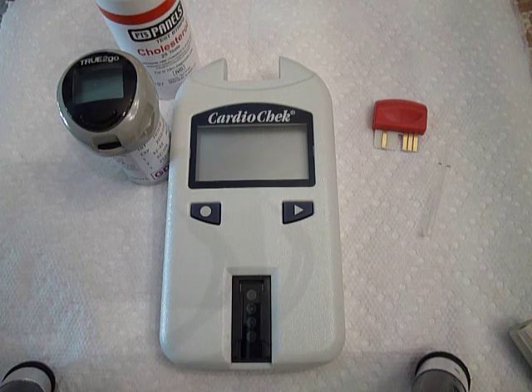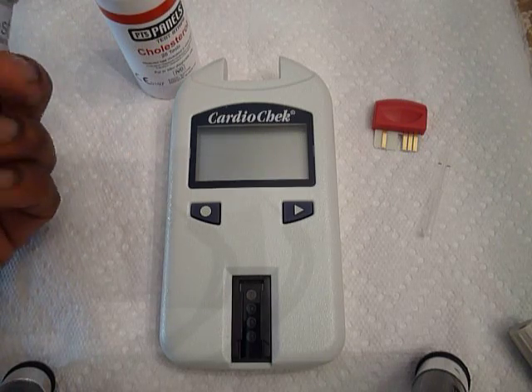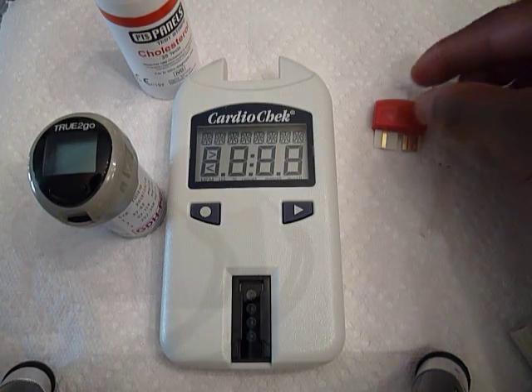This is going to be a short video of me performing a home health screening. I'm going to be using the CardioCheck cholesterol meter and the True to Go blood glucose meter.